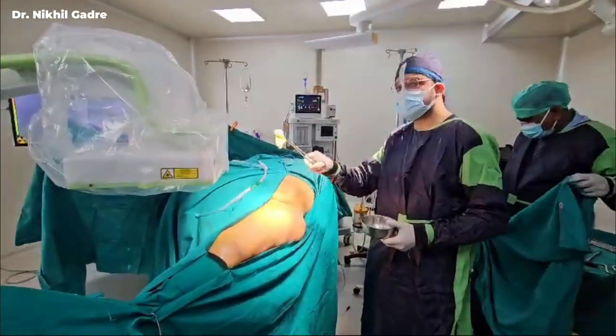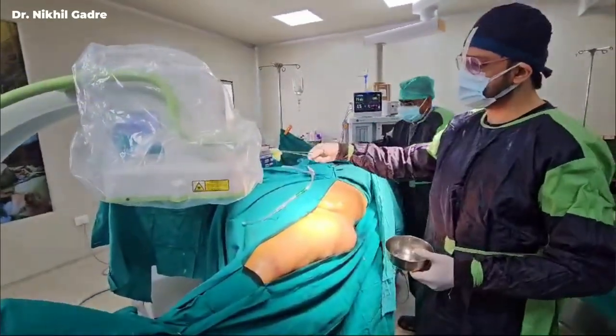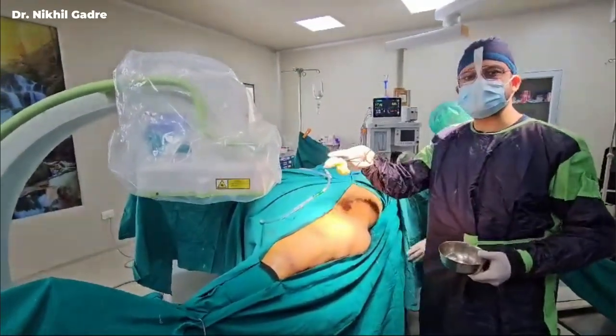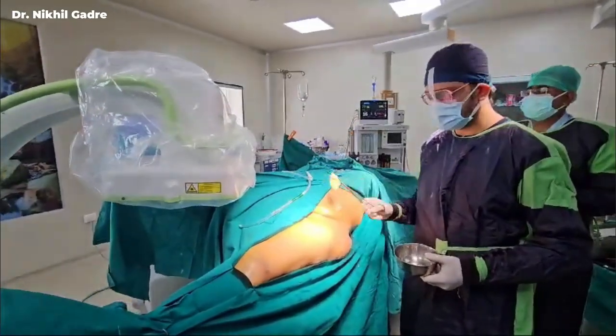This is our final position. The right lower limb is kept in a lithotomy position so that it doesn't come in the way. It is abducted and kept in a lithotomy position. This is the position of our C-arm. We can get a good AP and lateral view through this.